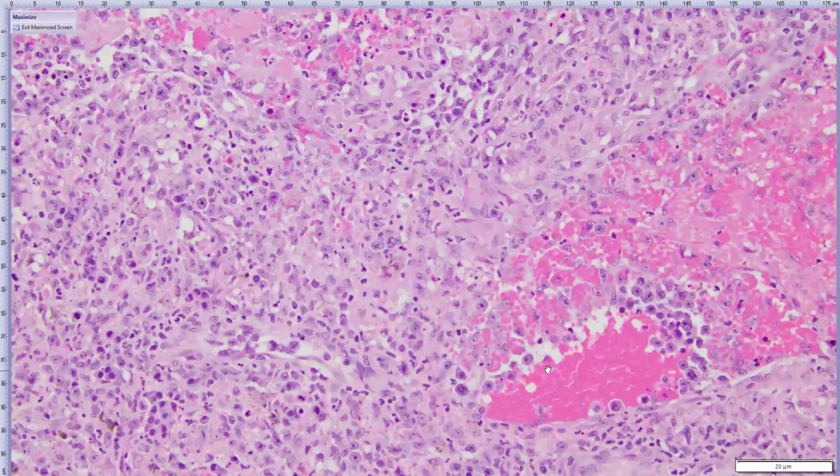The top differential in this case was given as lymphoma. So large cell lymphoma, because these round cells have nuclei that typically are greater than 2 erythrocyte widths in diameter. In particular, a differential that could be possible for this case is intravascular lymphoma. So I'm showing this in rounds because it's a really, really, really rare differential. This is not a confirmed case. I've really only seen one confirmed case of intravascular lymphoma in my whole entire life so far, so it is a really rare diagnosis. And this could easily just be lymphoma that's spreading to and or from the eye via the vessels. There is significant uveal stromal invasion in this case.